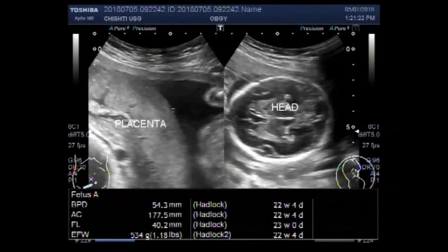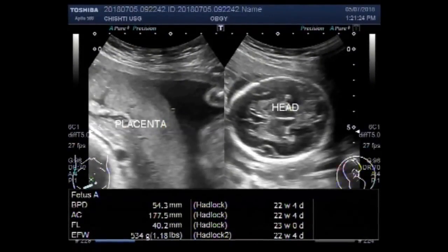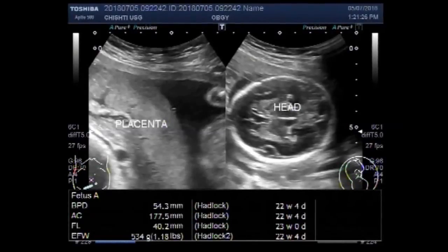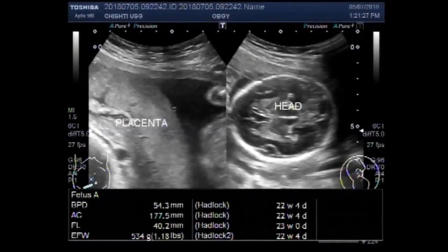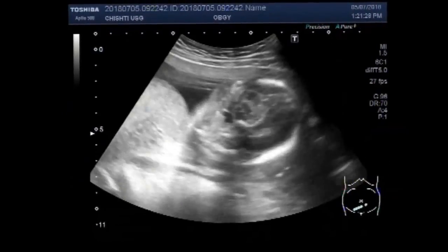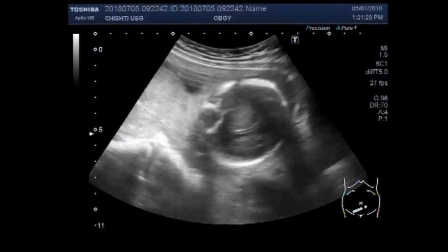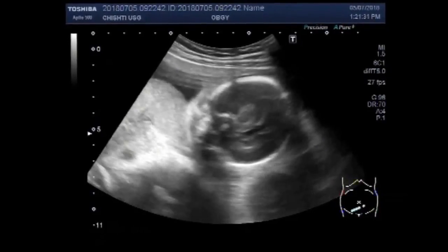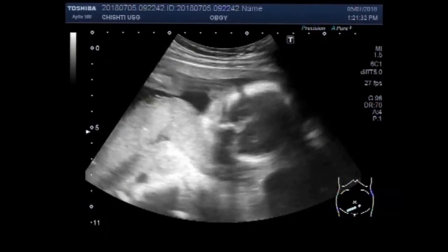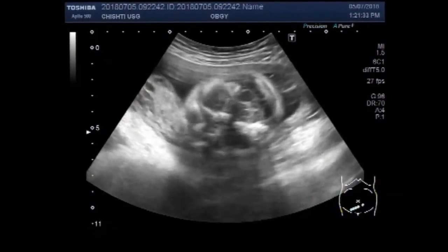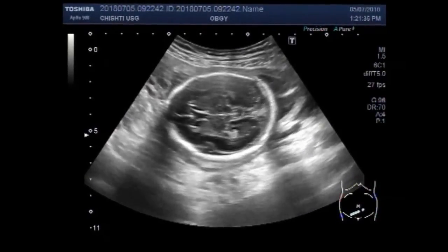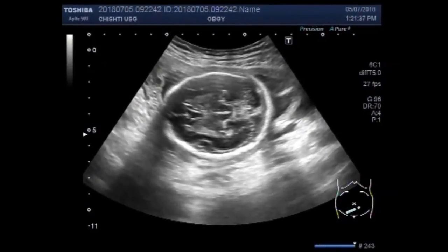Dear viewers, I hope you are all fine. This ultrasound video shows a normal intrauterine pregnancy, an ovarian cyst, and an ovarian ectopic pregnancy.